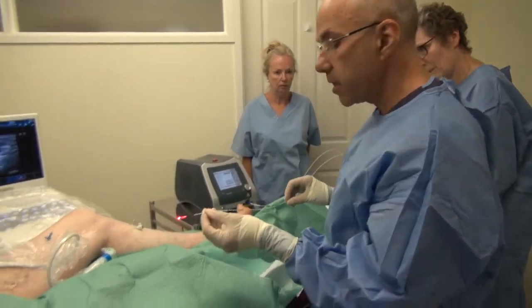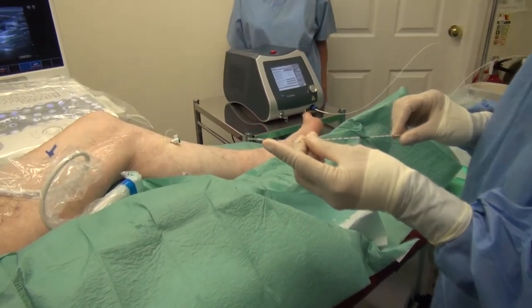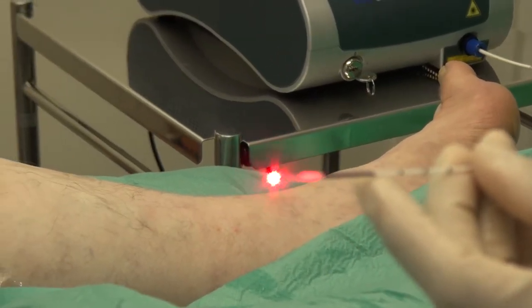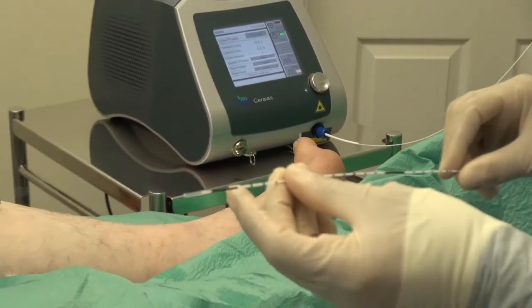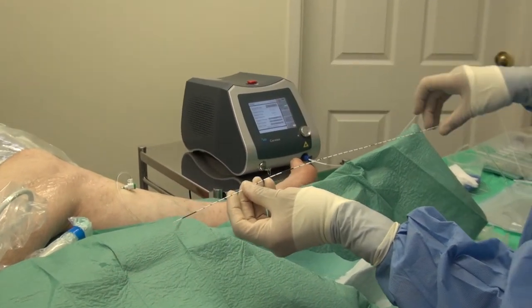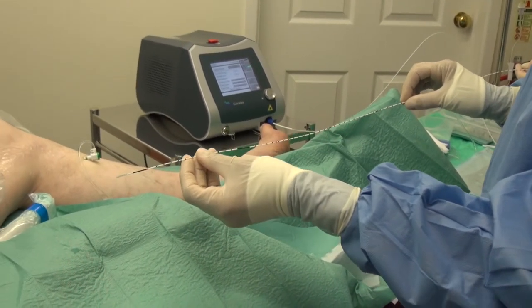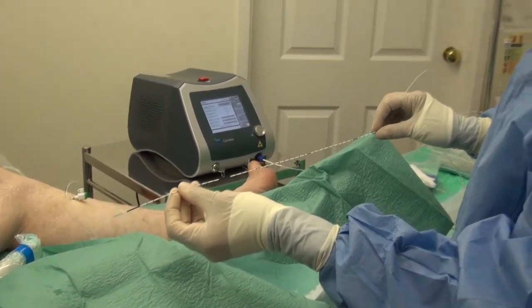The particular system that we use has a so-called aiming beam and that helps us position the laser fibre very accurately, and together with ultrasound we can be absolutely sure that the laser is in the correct place. It has various marking points on it which allow us to ensure that we deliver the correct amount of laser energy to the vein for a given length to ensure the complete success of the procedure.